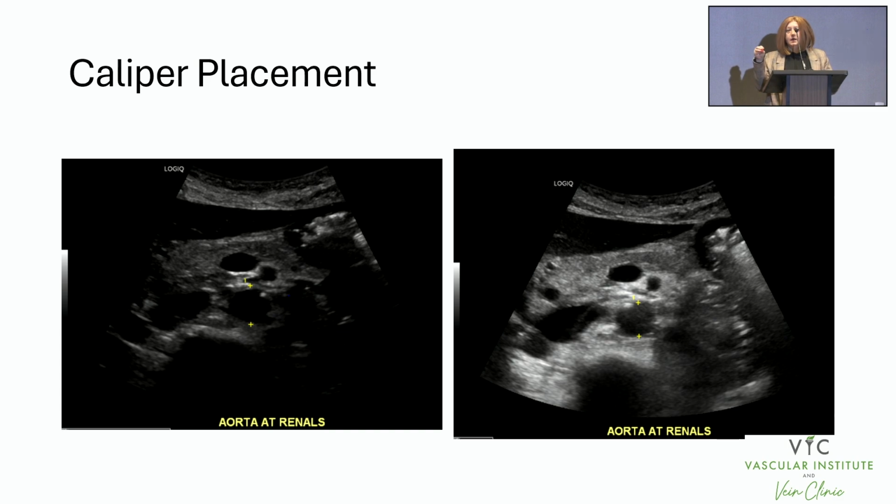They're thinking, well, did the aneurysm size increase or did it not? Maybe one tech appropriately measured it and another tech just threw it up there because it was 4 o'clock and they were ready to go home or whatever. So it really matters when you're surveilling aneurysms.